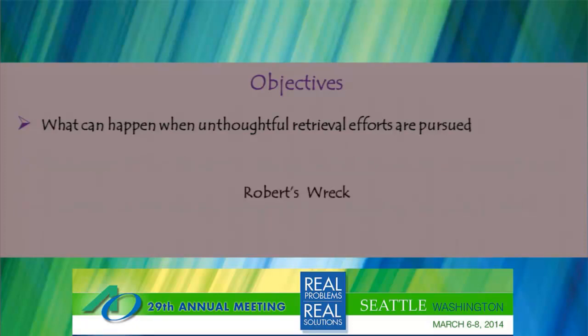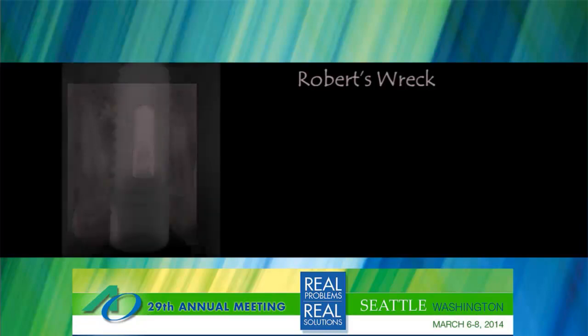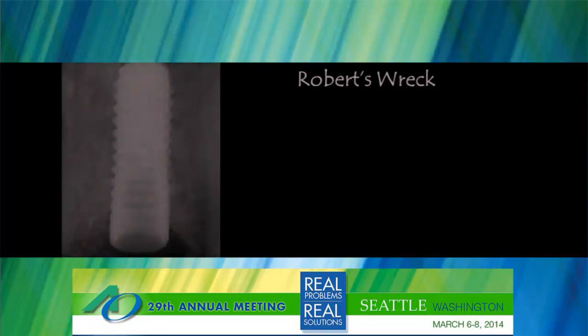So let's delve into the first case, and I called it Robert's wreck. Poor Robert had an unfortunate experience. He's in the LA area. They were about to seat a zirconia abutment and fractured the screw going into the case. And so I think panic ensued. I'll put the exploded version up here. And as pursuant to the first lecture we heard, performance went down as anxiety went up.